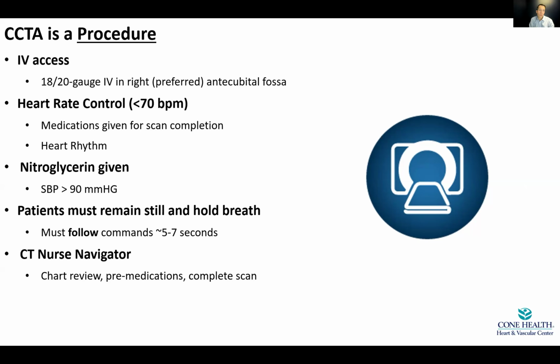Their heart rates have to be well controlled. We tend to give pre-medication with beta blockers orally 2 hours before the scan. We want to make sure it's an appropriate heart rhythm to scan. Blood pressure has to be appropriate. These patients do get nitroglycerin.